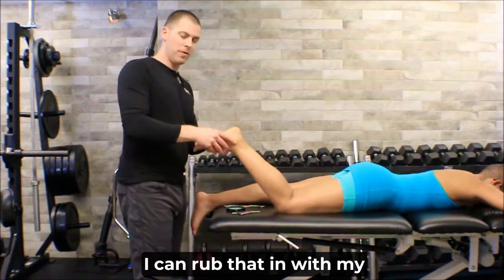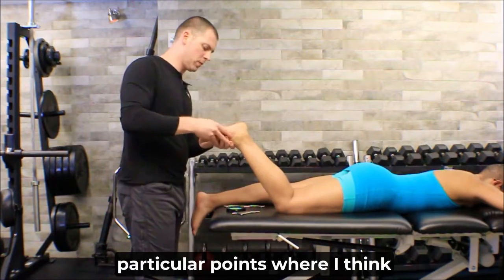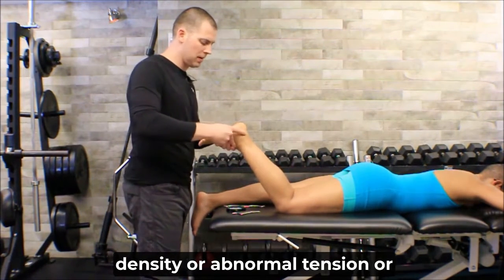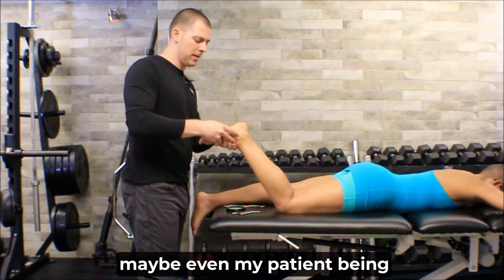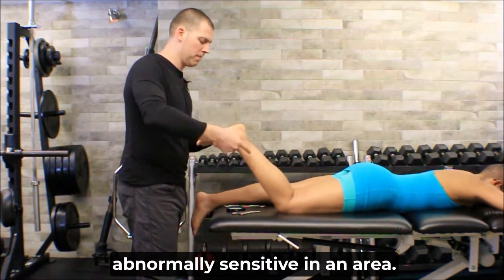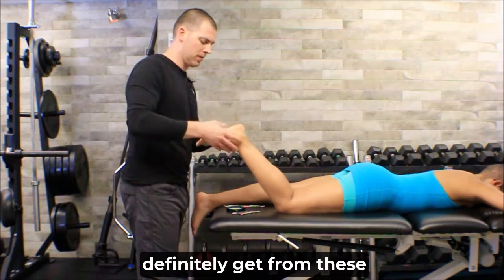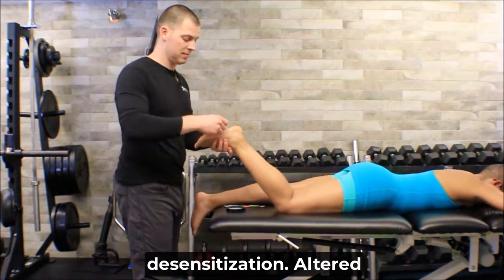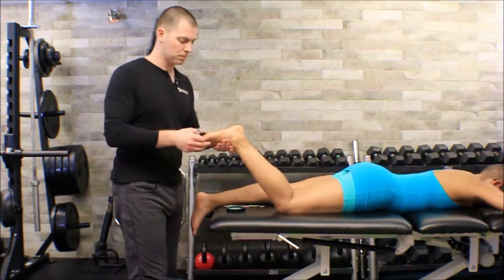Again, I can rub that in with my fingers and feel if there's any particular points where I think there's an increase in tissue density or abnormal tension, or maybe even my patient being abnormally sensitive in an area. One of the responses we definitely get from these IASTM techniques is some desensitization, right? Altered afferentation, which might decrease pain a little bit.